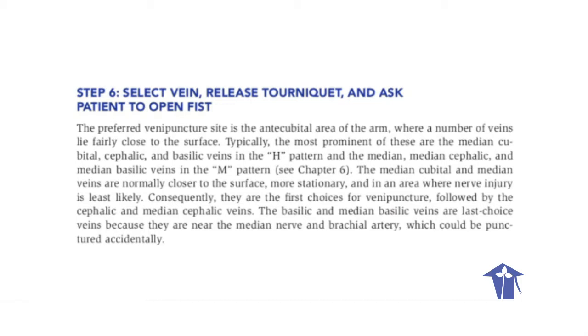The preferred venipuncture site is the antecubital area of the arm, where a number of veins lie fairly close to the surface. Typically, the most prominent of these are the median cubital, cephalic, and basilic veins.